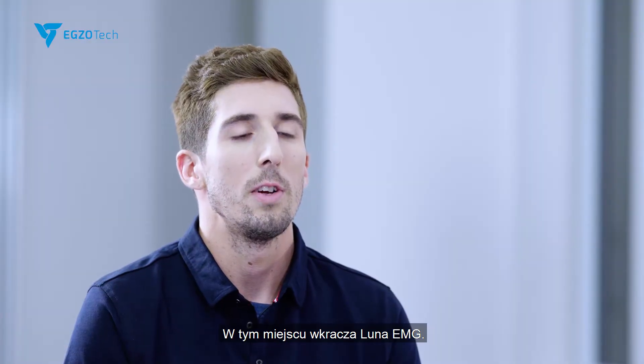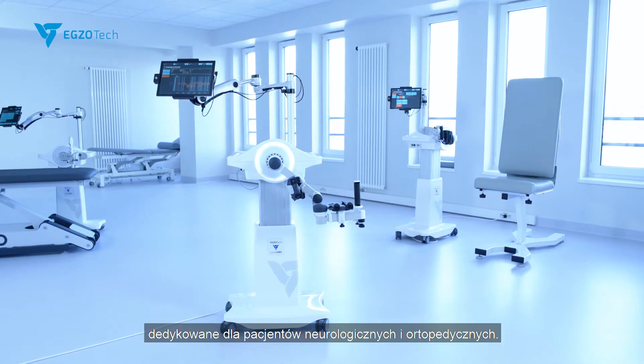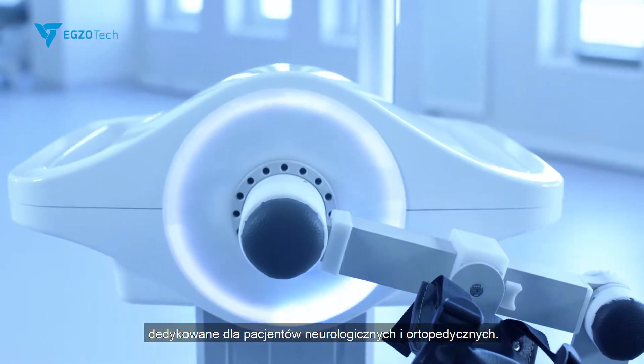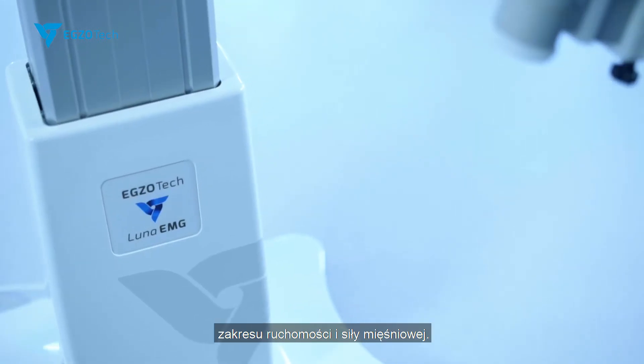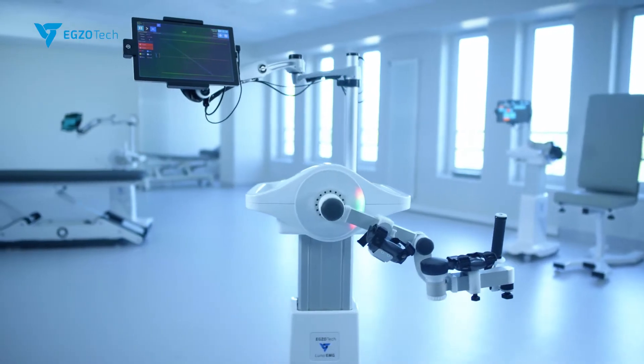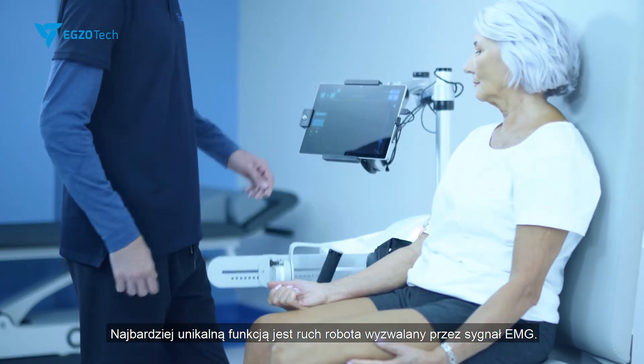This is where Luna EMG steps in. Luna EMG is a robotic device dedicated for neurological and orthopedic patients. It is being used as a tool to improve neuromuscular coordination, range of motion, and muscle strength. The most unique feature is the electromyography-driven robotic movement.